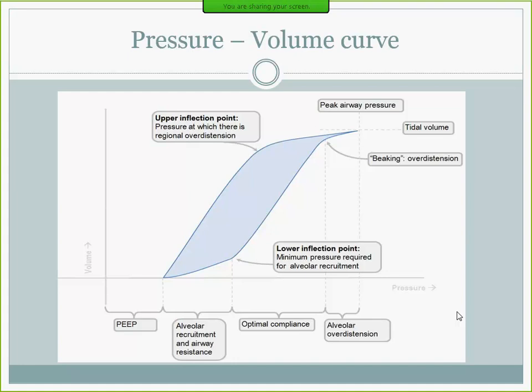So our goal is to keep as many alveoli open as possible, and at the same time to prevent over distension. If you allow over distension, it's going to rupture and you will end up with pneumothorax. So we don't want to create any iatrogenic problem for the patient. So the best thing to do is to ventilate somebody over here in the middle part of the lung. And I will go through how to achieve that particular goal. But that is your main goal of mechanical ventilation.